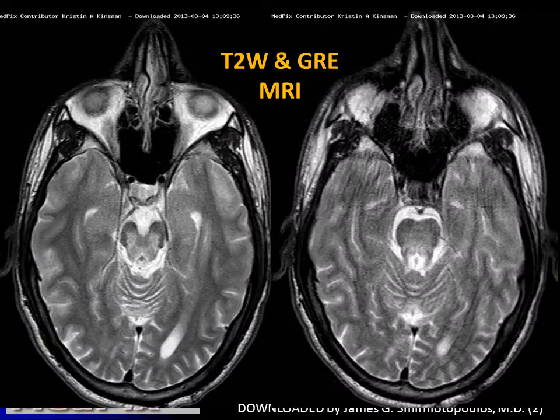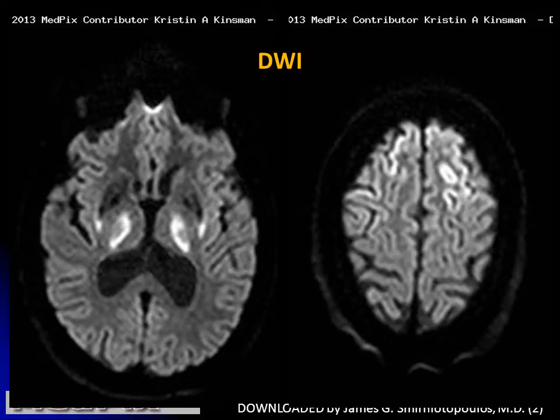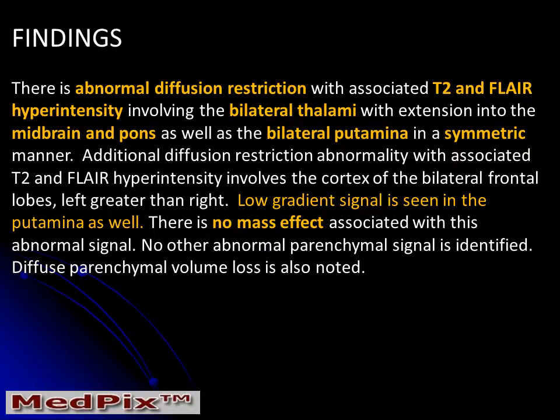He had abnormal MR images on T2 and GRE, showing abnormalities involving the thalamus and the lateral portion of the lenticular nuclei, the putamen. He also had diffusion abnormalities involving the cortex and the thalami bilaterally. In summary, this patient had abnormal diffusion and abnormal T2 and FLAIR hyperintensity involving bilateral thalami, the midbrain and pons, and bilateral putamina, in a symmetric pattern with no mass effect whatsoever.